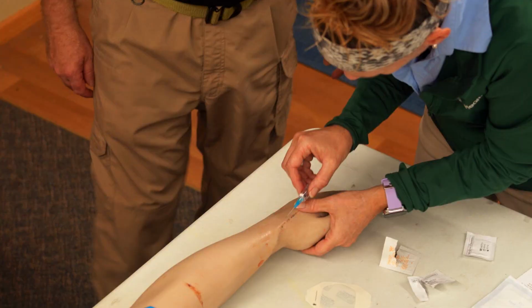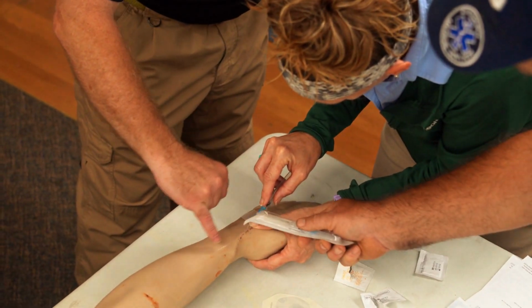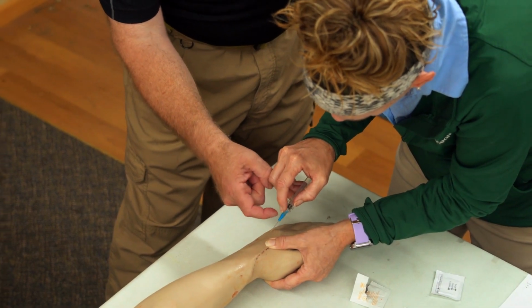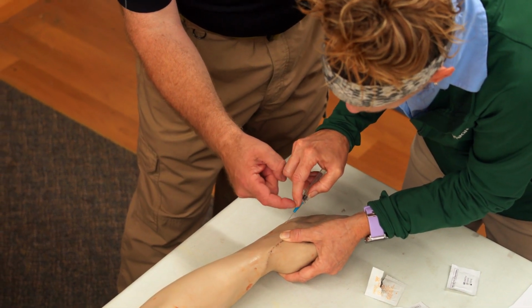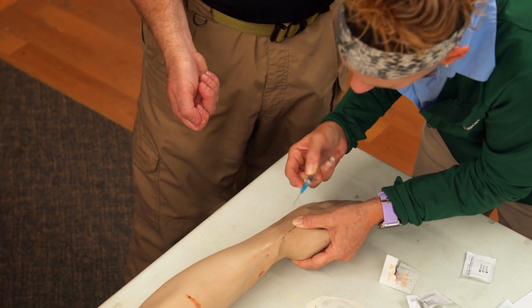Okay, so keep that anchored. Where are you trying to hit? You're trying to go up this one here? Finger up on this notch, this finger, put it up there. Put that there. And, yep, but pulling back. Yes, there. Yes, yes, there you go. Because if you push on that, you're good.